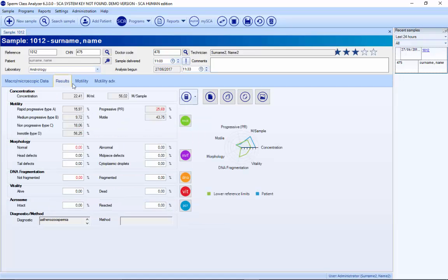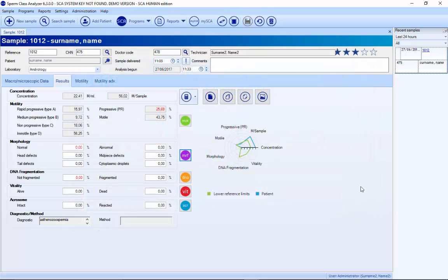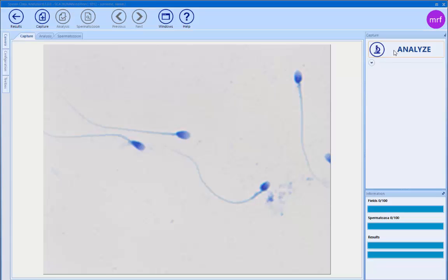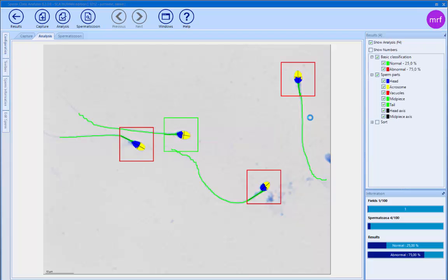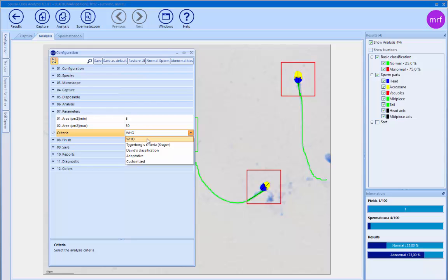For morphology, we go to morphology, select the configuration — it's possible to use different stains — and then press analyze. The system searches for each sperm and classifies whether it's normal or abnormal. It's possible to select different criteria: WHO, Tigerberg, David, David Modified, and Adaptive — which allows you to customize the criteria to put your own values.